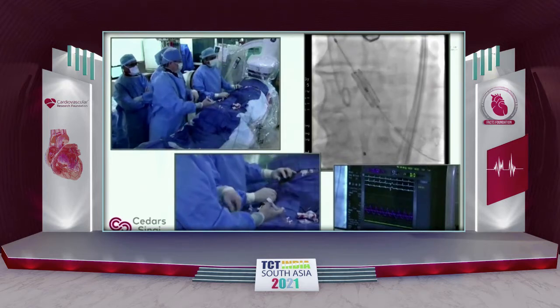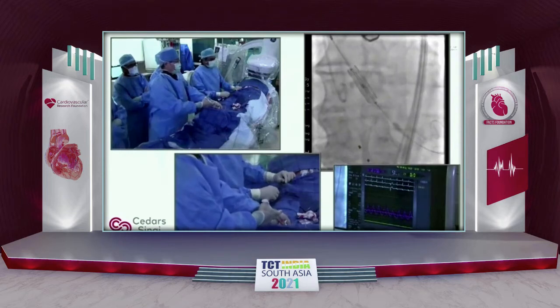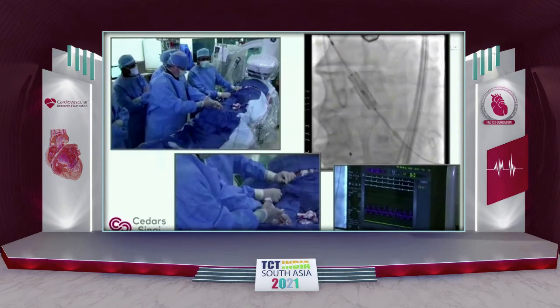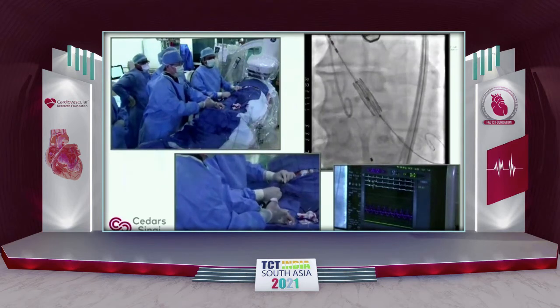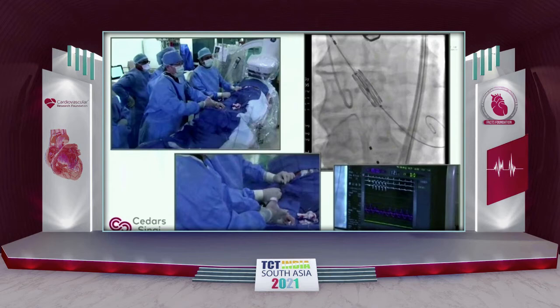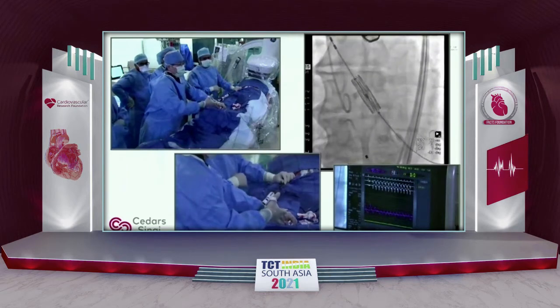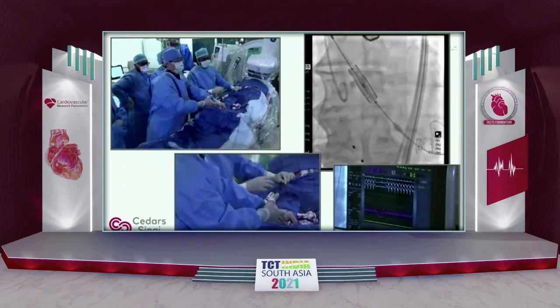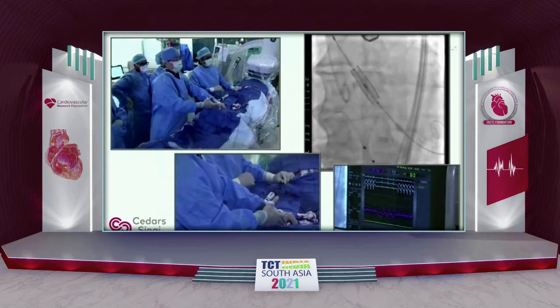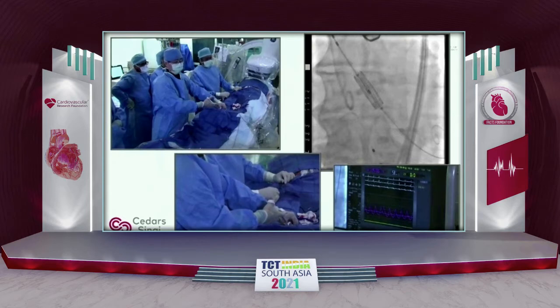Okay, you will go up when you see that we are fully captured. All right, are we ready again? Pacer on. Are you testing right now? I think the pressure should become zero totally when you're rapid pacing, so that helps. So what is your rate? 180? Okay, so for whatever reason, I guess we were not capturing.